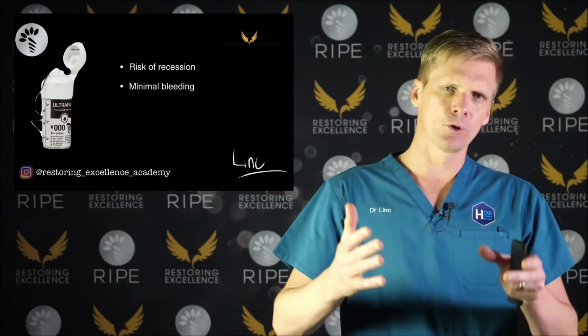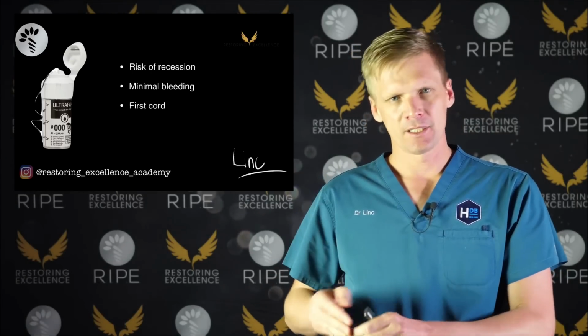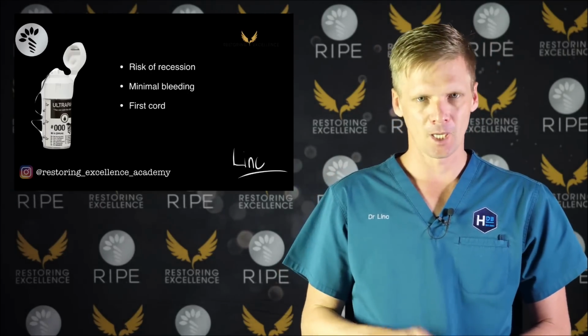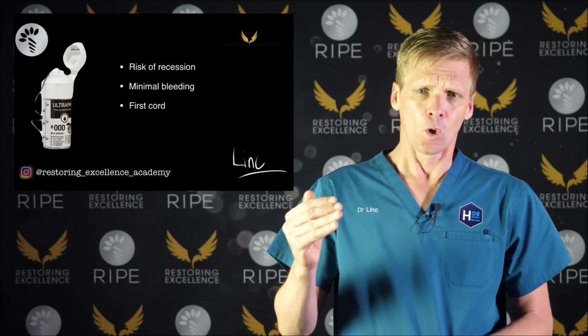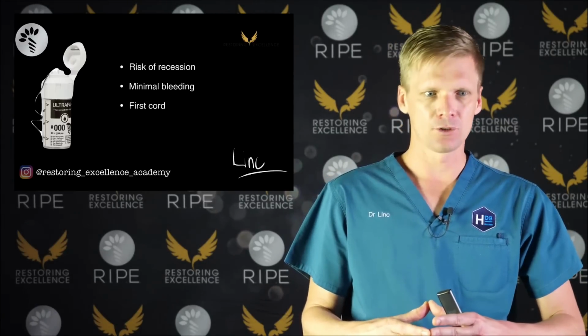When I'm doing multiple cords, which is for impressions, unless they're veneers in a very healthy patient, I'm always going to put 2 cords in. And I'll explain why that's so important. It has to do with the wettability of the silicone. So when I'm taking impressions, always the first cord, I'm going to have the 000.